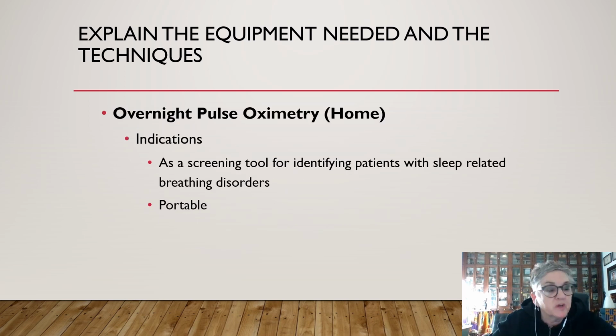Overnight pulse oximetry or home oximetry is used as a screening tool for identifying patients with sleep-related breathing disorders. It's portable and easy to wear.